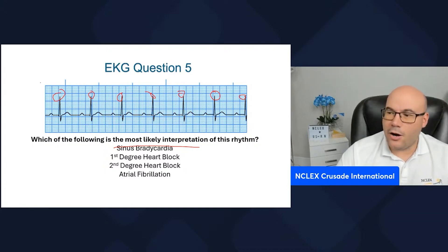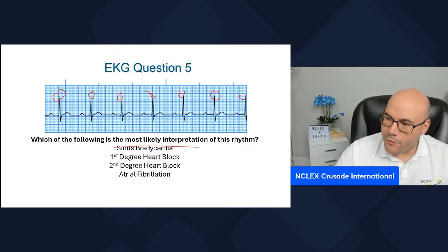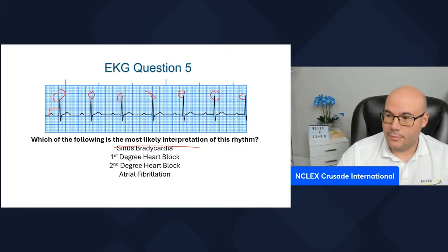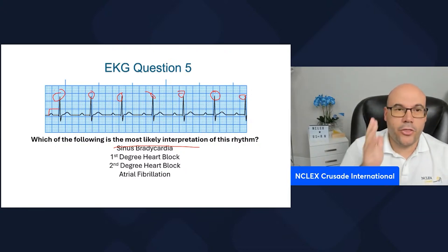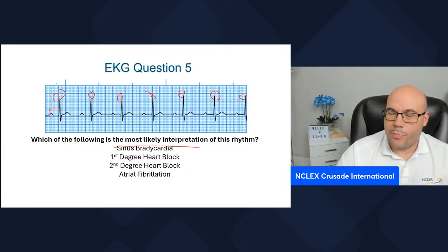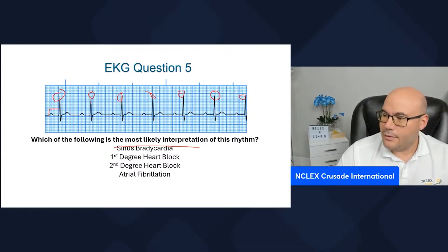What about the PR interval? We measure the PR interval from the beginning of the P wave to the beginning of the QRS. We see that we have a big square and two small squares — we have seven small squares. That's too long. Remember, it's supposed to be between three and five small squares. We have seven small squares, so we have prolongation of the PR interval, and it is constant on the EKG strip.